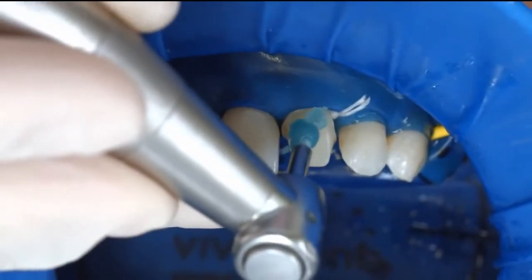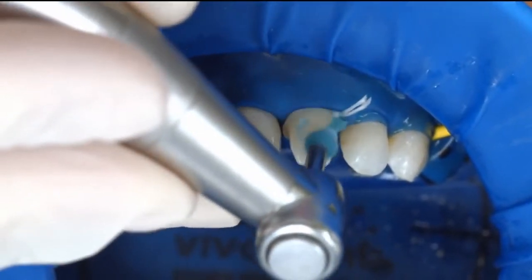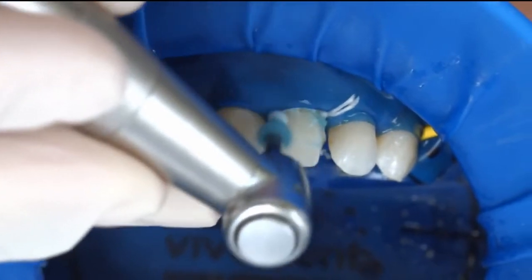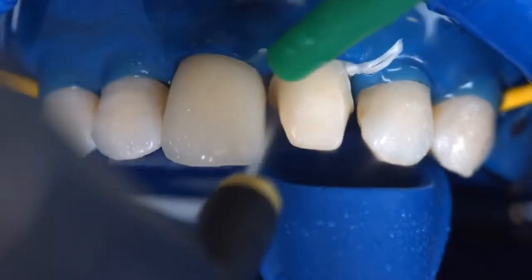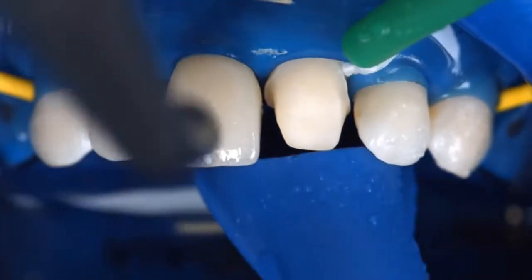Clean the preparation again with a polishing brush and fluoride-free cleaning paste such as fluoride-free Proxit. Rinse the preparation with water spray and dry it with air. Avoid over-drying.